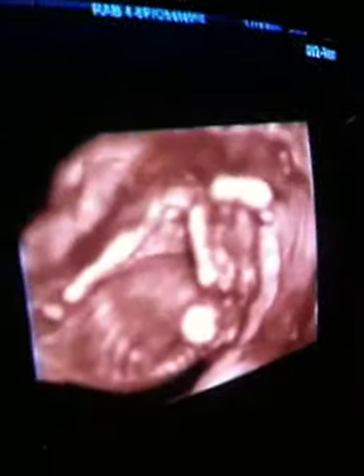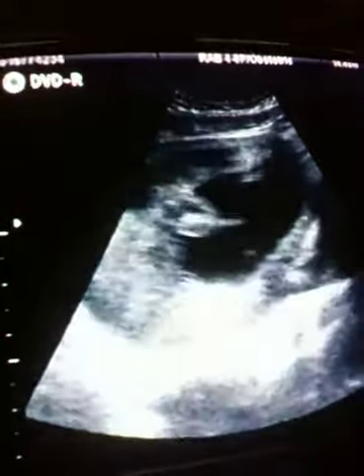I hope I'm not messing up. There we go. Alright, Miss Pris, your legs — you got some long ones. Who does, Mom? Let's see if I can get her face too. She's way low, man. There's the back of her. Look at her feet. She is really, really low. Head's low — booty's way up here. There she goes, spread eagle. Now she says, here you go, now you can totally see. Look at those legs sticking straight out. It's so obvious. Okay, it's nice, but it's nice I maintain it.